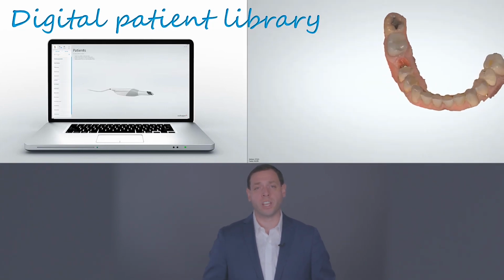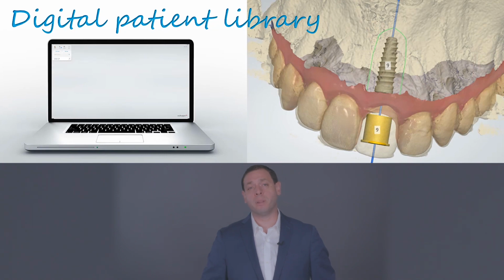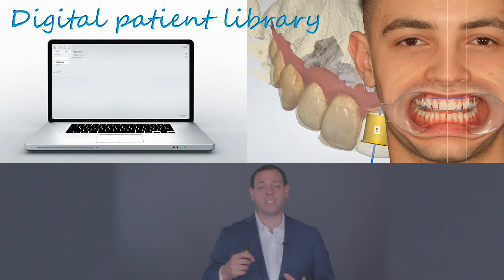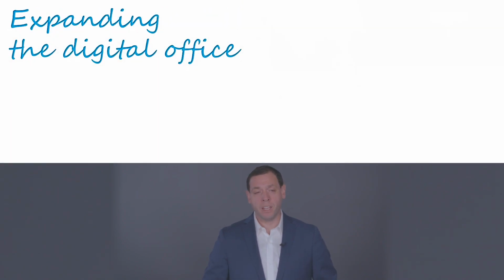whether it's an intraoral scan, whether it's a 3D surgical implant plan and guide, or whether it's a digital smile design, or it's an analysis of where we need to set up teeth. We want to keep all this information within our digital patient library.